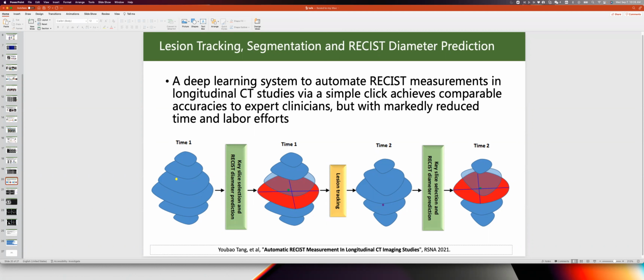As in the demos, you can input different clicks to our model and it can produce consistent results. We clicked 10 times and got 10 different prediction results, so we can compute the standard deviation.